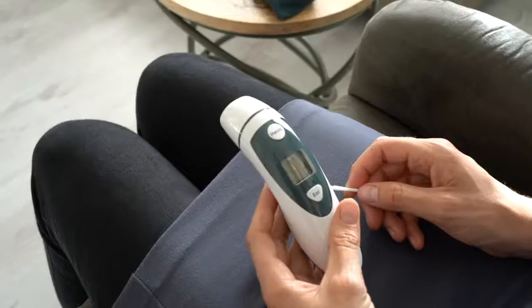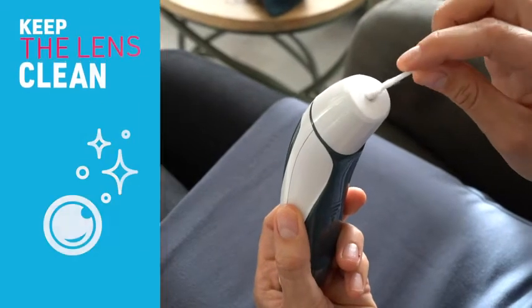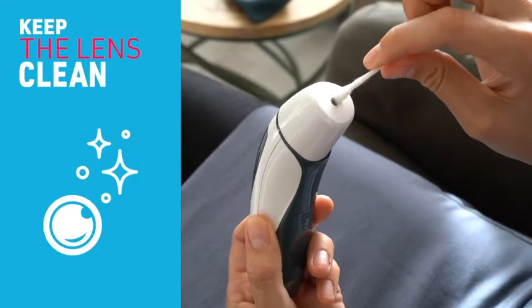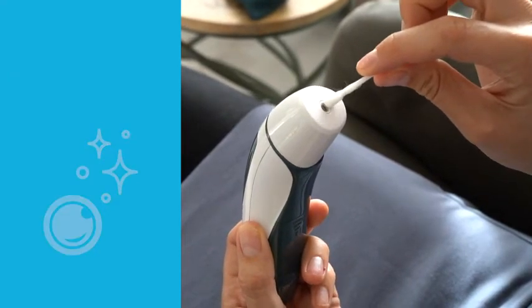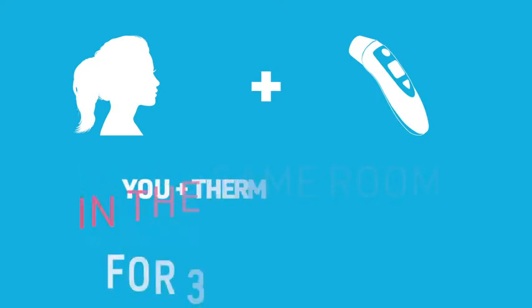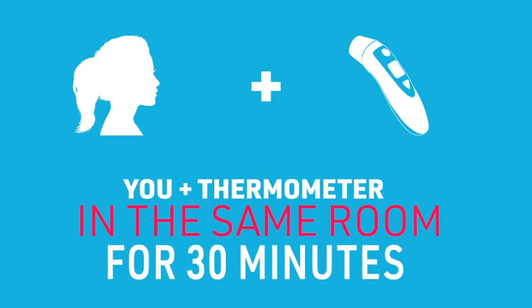Keep in mind, make sure to clean the lens with rubbing alcohol before and after every use. This will avoid inaccurate results caused by a dirty lens. Before using the thermometer, make sure it has been in the same room as you for at least 30 minutes. This will make sure the thermometer is acclimatized to room temperature.